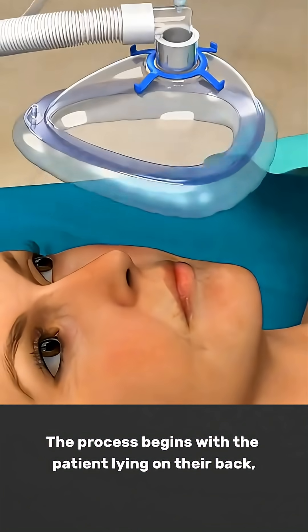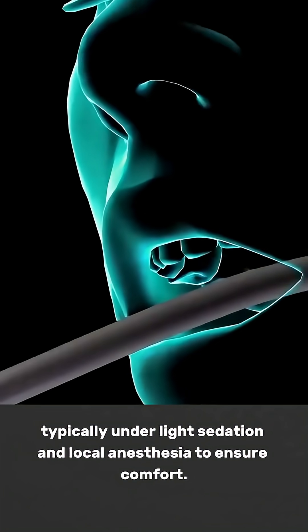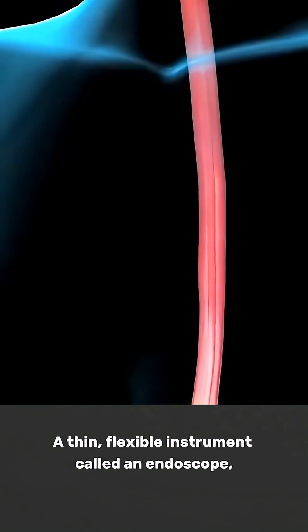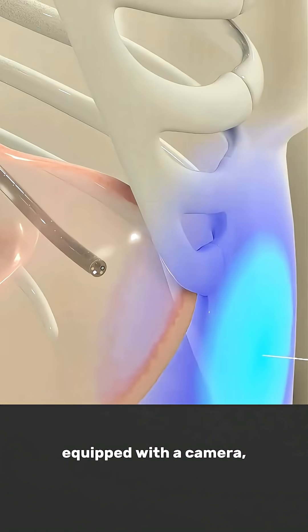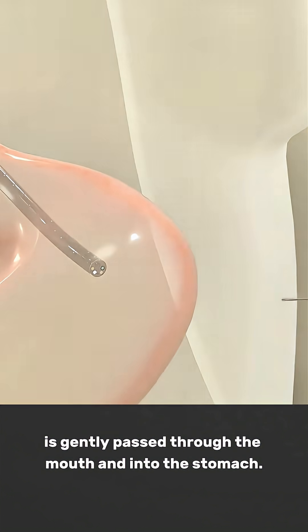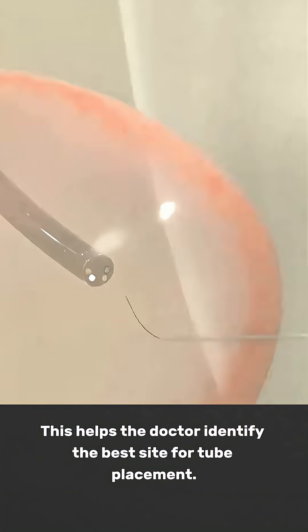The process begins with the patient lying on their back, typically under light sedation and local anaesthesia to ensure comfort. A thin, flexible instrument called an endoscope, equipped with a camera, is gently passed through the mouth and into the stomach. This helps the doctor identify the best site for tube placement.